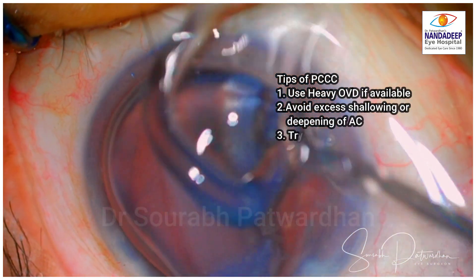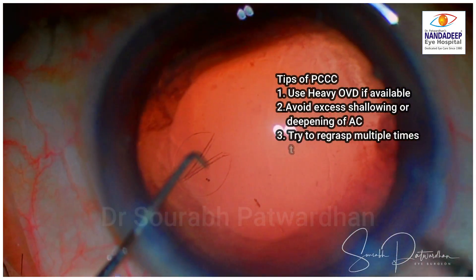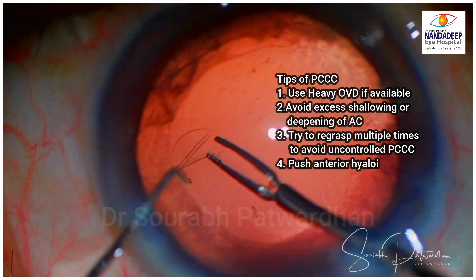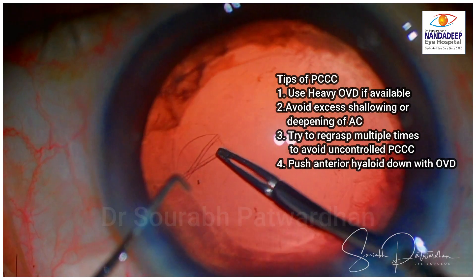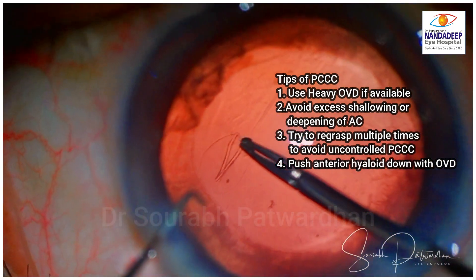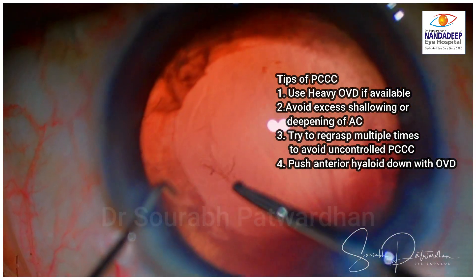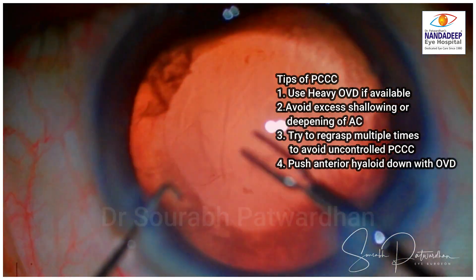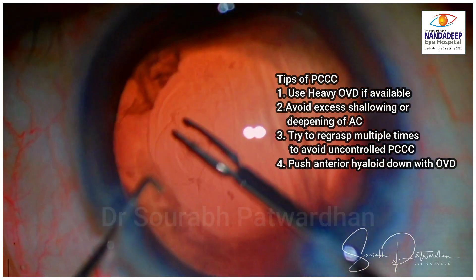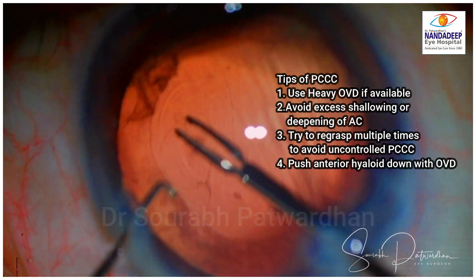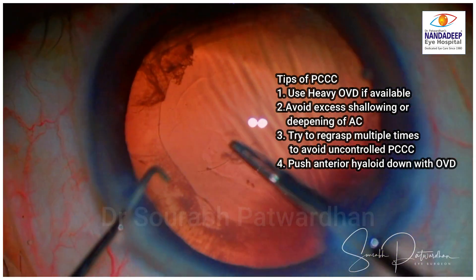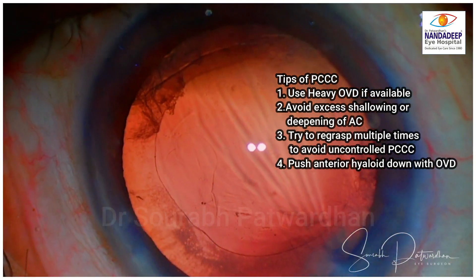I am going to convert it to PCCC. Use heavy OVD if available, avoid excess shallowing or deepening of the anterior chamber, and try to re-grasp the tear multiple times. That avoids uncontrolled PC rupture extension, and push the anterior hyaloid down with OVD if you feel it is bulging up, because you don't want to rupture the anterior hyaloid.